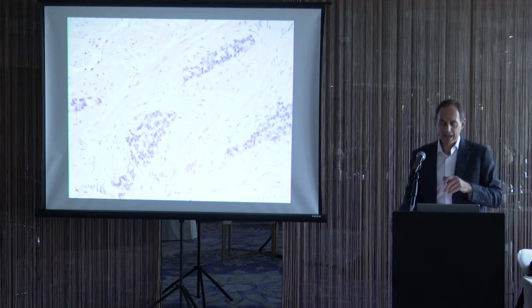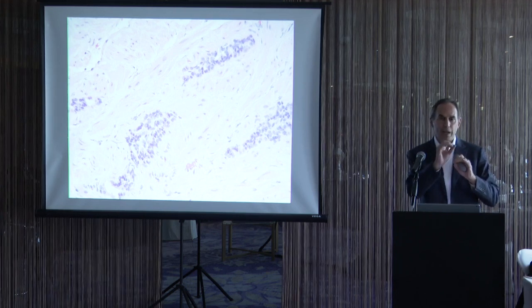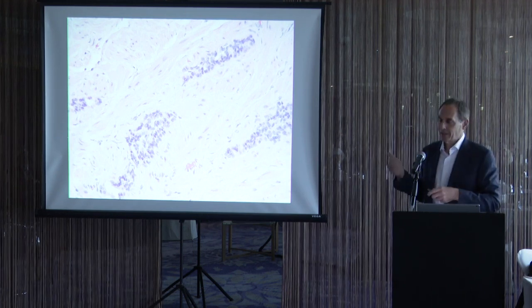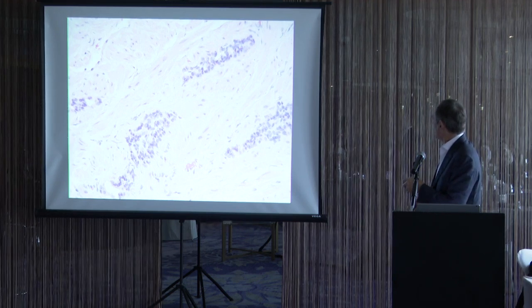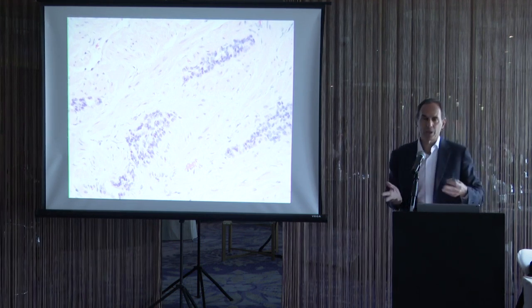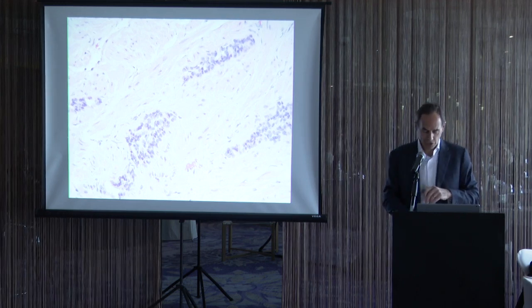Another pitfall with atrophy is if you think of prostate cancer, some of them are cylinders or pipes. You can imagine shearing the top parallel to the pipe, just the surface of it, and you can get, if it's an atrophic gland, a structure that looks like this, where you have these very bland nuclei, very scant cytoplasm, but they're going to make these cylinders or columns. That's not a pattern that you see with prostate cancer. That's just post-atrophic hyperplasia tangentially sectioned.